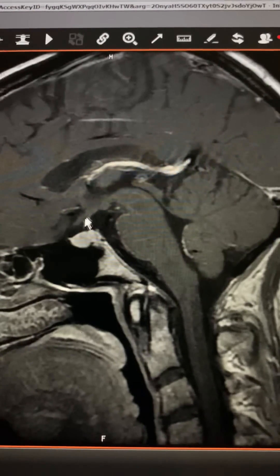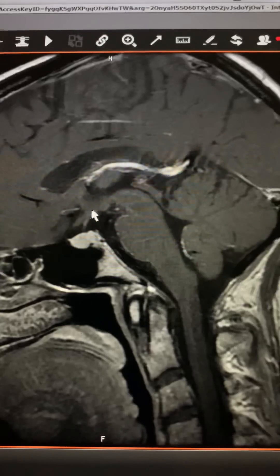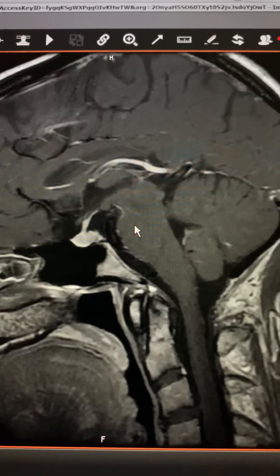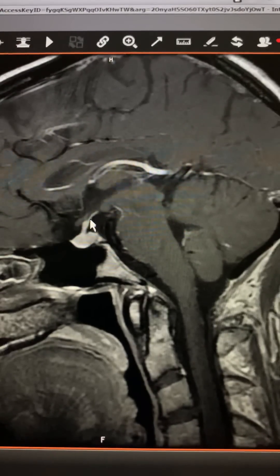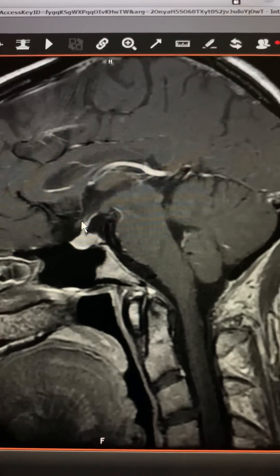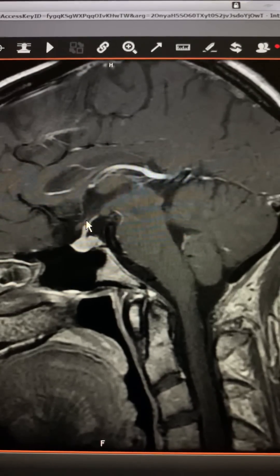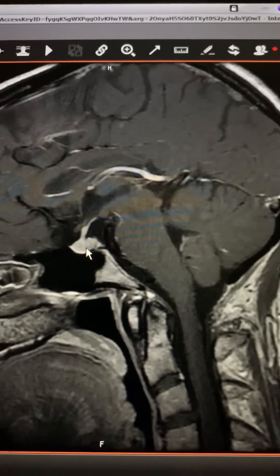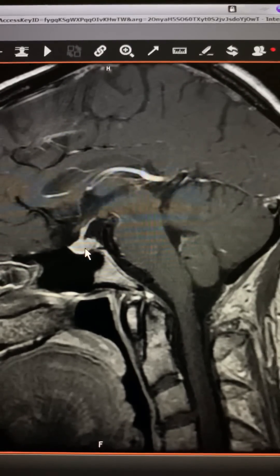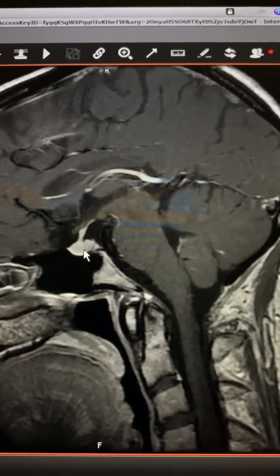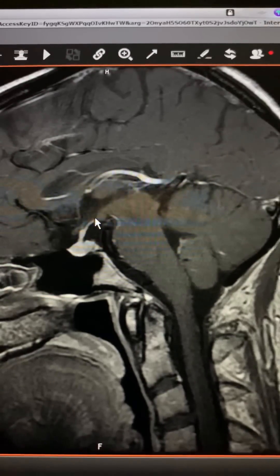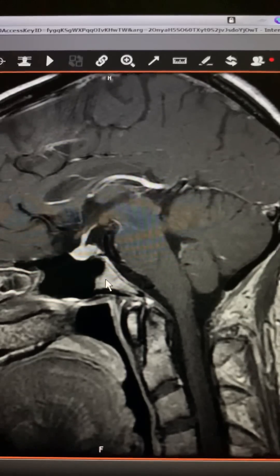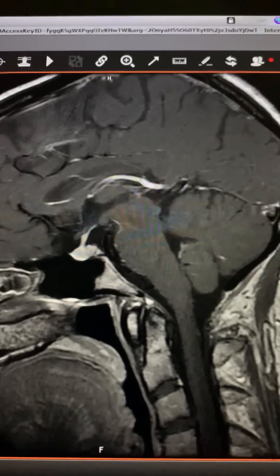I'll show you the pituitary stalk on another image where it shows up a little better. This area here is the hypothalamus, and here's a better image showing the pituitary stalk or the infundibulum. This part that's swollen at the top is called the median eminence. The pituitary stalk is composed of nerve fibers that go from the hypothalamus to the back part of the pituitary. It's also composed of blood vessels — a portal venous system, and probably some arteries as well — that carry blood from the hypothalamus to the anterior pituitary so that the hypothalamic hormones can be delivered to the anterior pituitary.